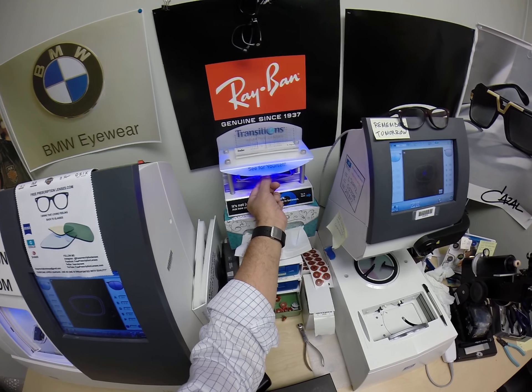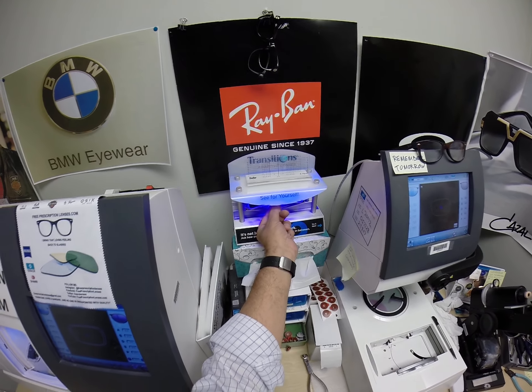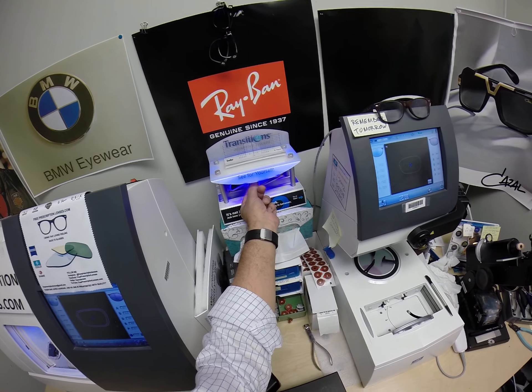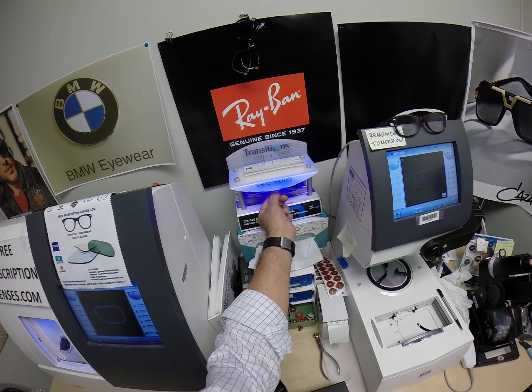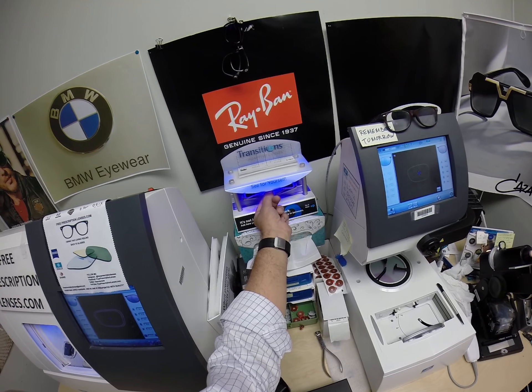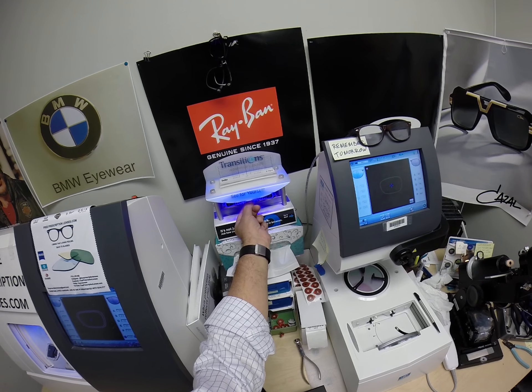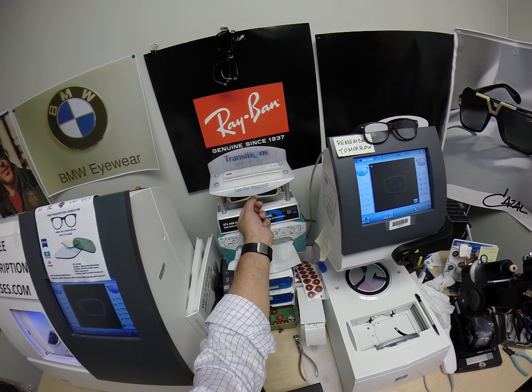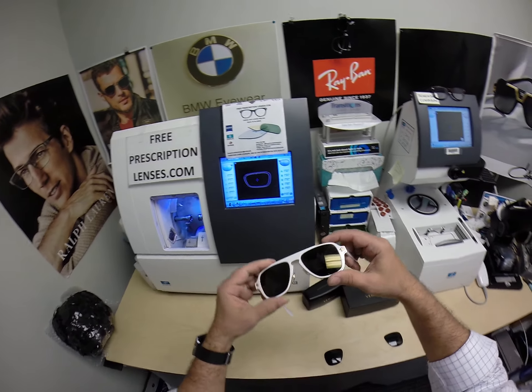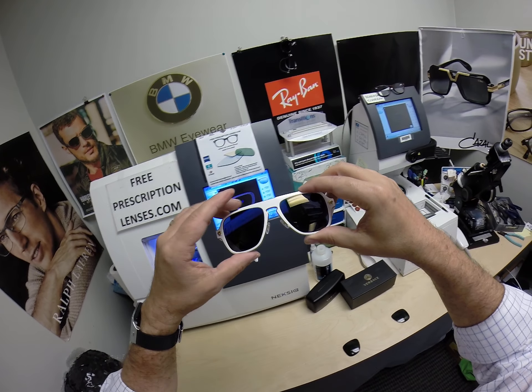Now if you have a convertible or a motorcycle, they will darken. They're also temperature sensitive, meaning they will get darker when it's 85 degrees and below than when it's 95 and above. But I remind everyone: when it's 100 degrees outside, you're miserable, they're miserable — nothing works 100% when it's 100 degrees outside. These Photofusion extra gray are designed for extra active people who spend extra amounts of time outside, and will get darker in hotter weather.